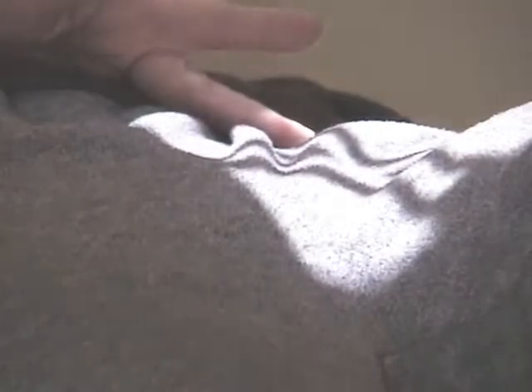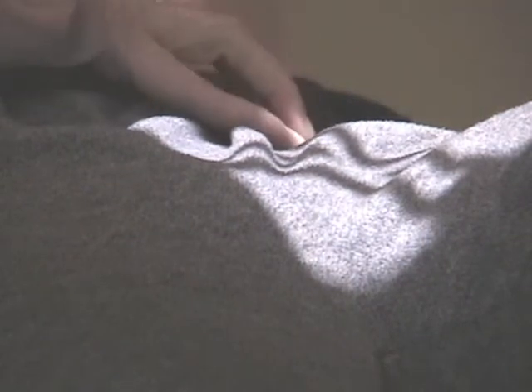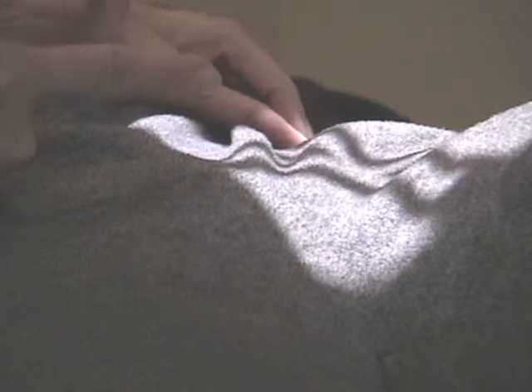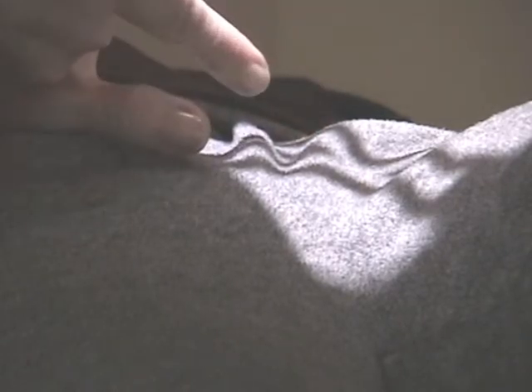I do not have to palpate this patient at all once I get the ASIS landmarked. Let me kind of show you what goes through my head when we do this. ASIS, I imagine the pubic bone, do not touch. I draw that imaginary line, cut it in half, go 2 inches down. You've got some hints here. If you can see the crosshair with the camera, I'm going to have the patient move her leg just a little bit. See how that is right in the crease of the leg? I think you can see that.